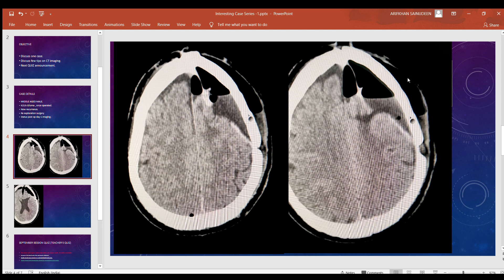The CSF is tracking and instead of collecting in the subdural space, it is collecting in the extradural space. There is also an air-fluid level, which is very common in cases of pneumocephalus — you can develop air within the cavity intraoperatively or postoperatively. There is even air in the scalp with fluid leveling. You should notice that the fluid in the scalp has the same attenuation — this is actually CSF, suggesting a momentary CSF leak that may have occurred during the intraoperative period. On follow-up imaging at days 2, 3, and 4, there was no significant increase in the scalp collection, ruling out a ventriculocutaneous fistula.